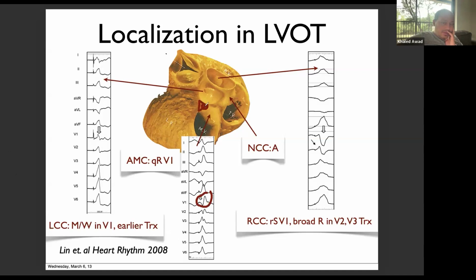We said anything that is on the mitral valve will be positive V1 through V6. We call that positive concordance. And that's why when we see a rhythm that is positive in V1 through V6, a wide complex rhythm, we always say it's VT. It cannot be SVT. There's no SVT that activates the heart at the mitral annulus. The Purkinje system does not activate the heart beginning in the mitral annulus. It always activates the heart in the middle of the ventricle. It's never at the mitral annulus. So that is diagnostic for VT. And if it's negative concordance, where it's negative in all precordial leads, it's in the LV apex, and the conduction system doesn't go to the LV apex directly either. So these things are suggestive of VT for that reason.